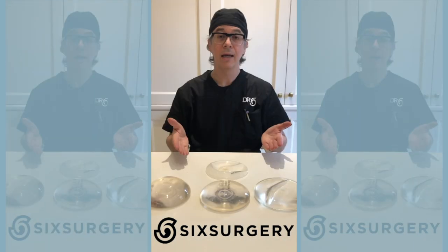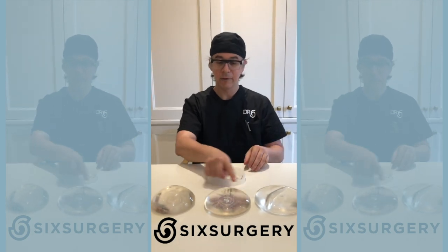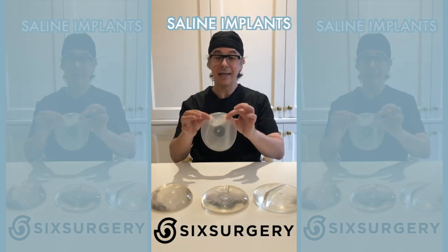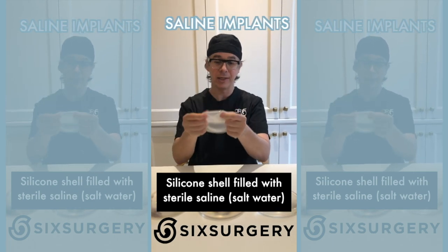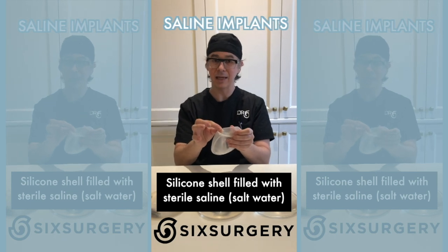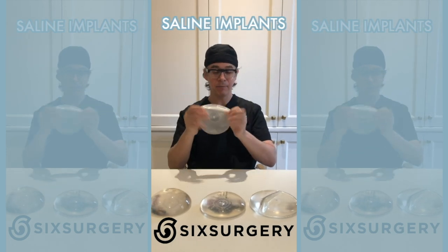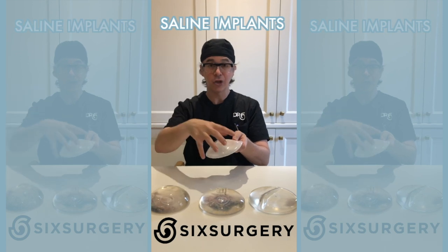Here we have a bunch of implants — a saline implant and three different silicone implants. A saline implant is a silicone shell, so it still has silicone. The bag that holds it is silicone, and this shell is exactly the same whether it's a saline implant or a silicone implant. The difference is that saline implants come empty.